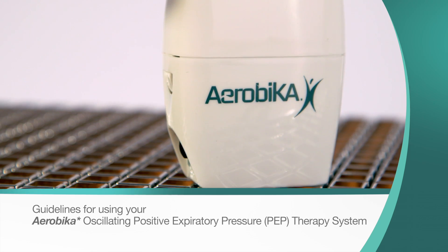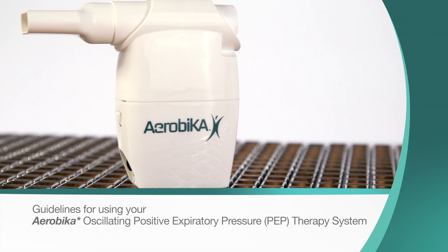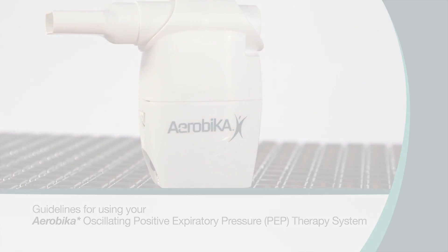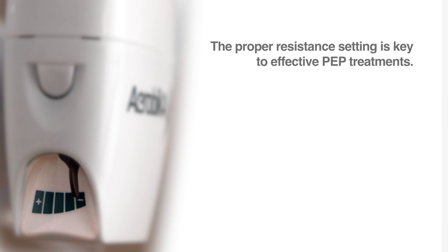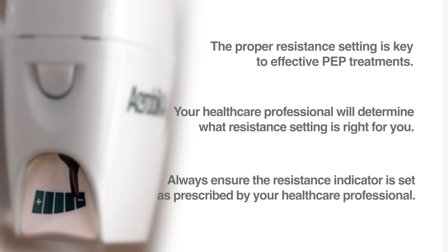Please follow these simple instructions when using the Aerobica Oscillating Positive Expiratory Pressure Therapy System, or oscillating PEP device. The proper resistance setting is key to effective PEP treatments. Your health care professional will determine what resistance setting is right for you. Always ensure the resistance indicator is set as prescribed by your health care professional.